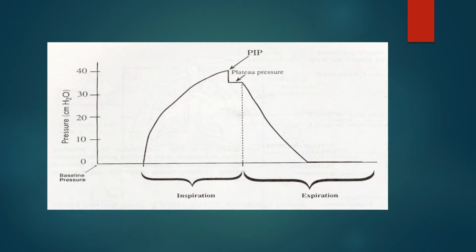Now here we have what is called a waveform, ventilator waveforms. We can see pictures of breaths. We have waveforms called scalar waveforms, and we plot on this axis a respiratory parameter. In this case we have pressure, but that could be the volume, the tidal volume in and the tidal volume out, and it could be the flow going into the patient and the flow coming out of the patient. Here we're looking at pressure.